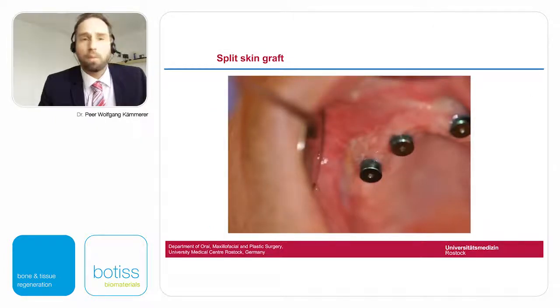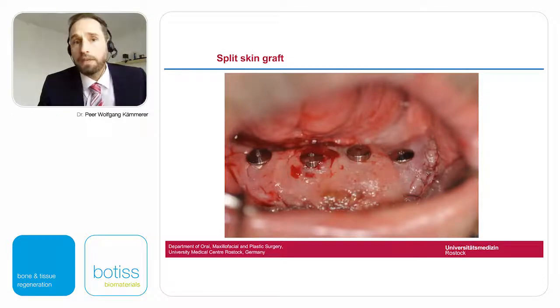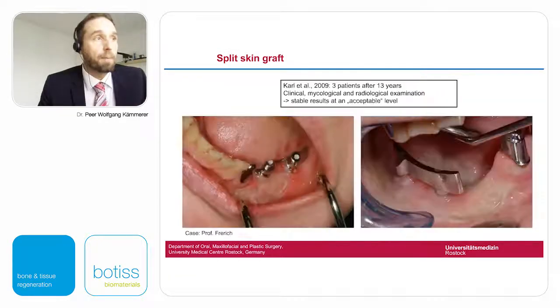Here you see once again a result after a skin graft, a small skin graft. You see there are slight differences in color, even if the functional results we encounter are quite good. Once again, this is after healing of 2 weeks, a large skin graft, and you see a big graft was needed, and well, it works, but it has its own problems.